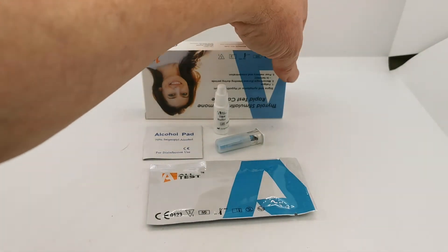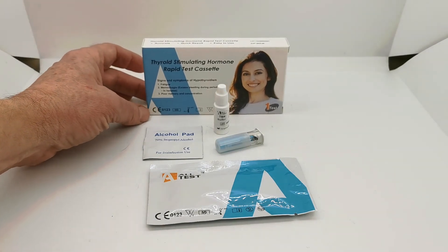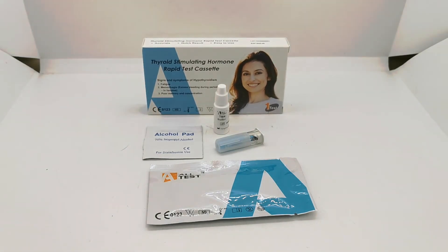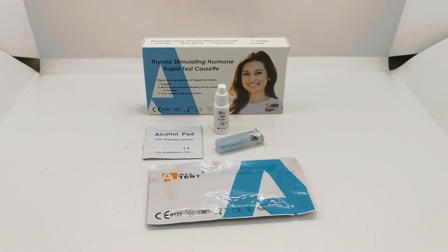So it's a simple, easy to perform complete home testing kit allowing one person to test one sample of venous whole blood or capillary whole blood. The lancing device allows you to do this without having to use needles or syringes, and it gives you the results in under 10 minutes.